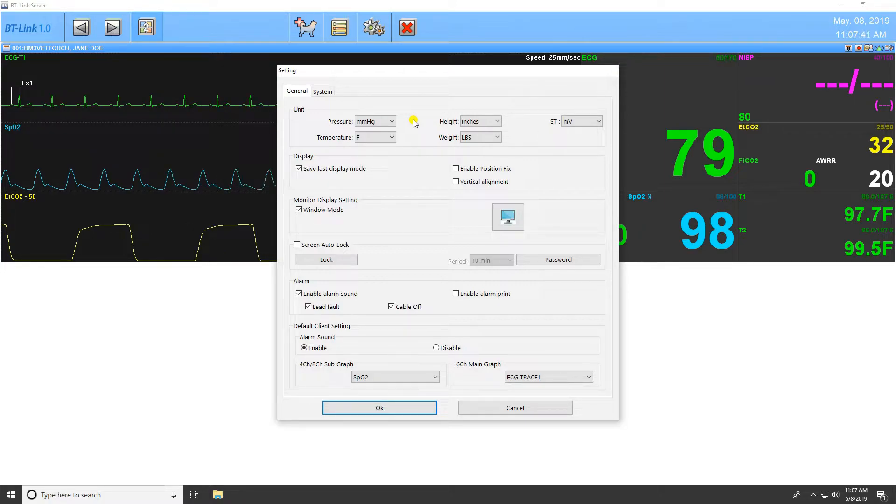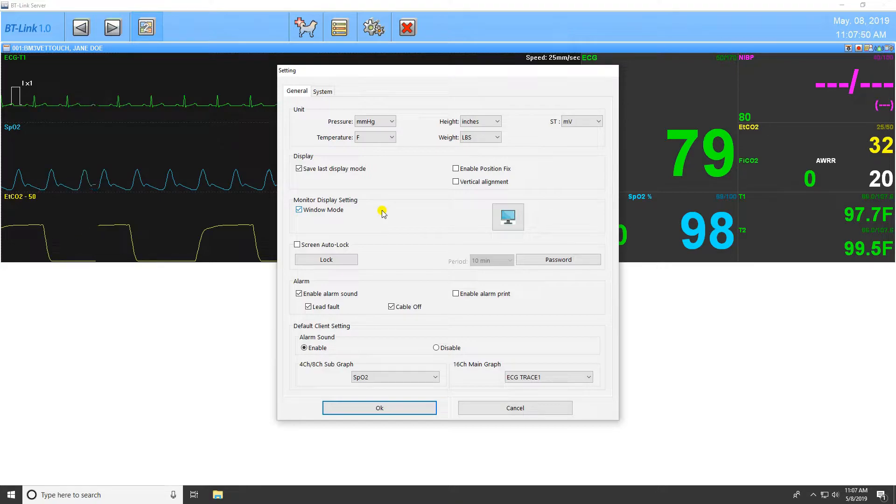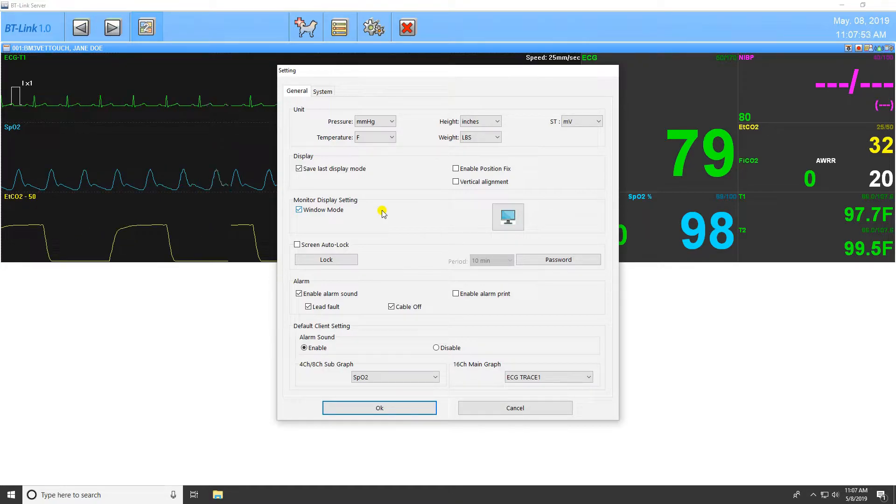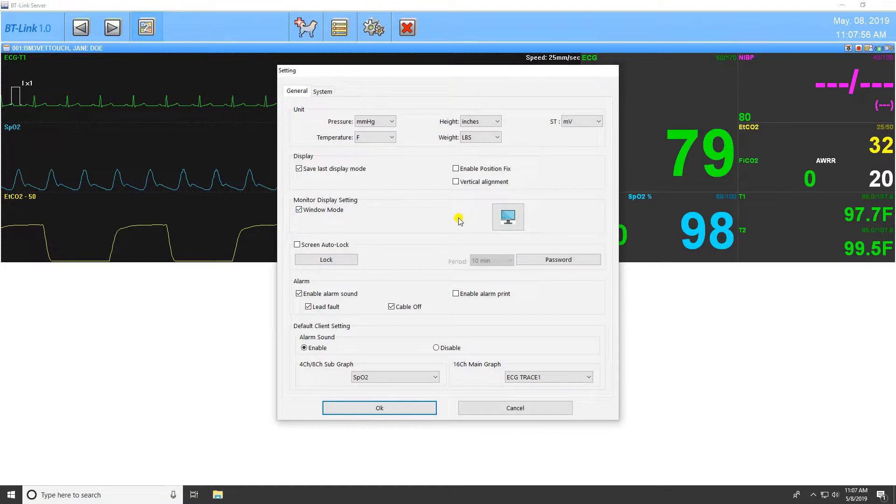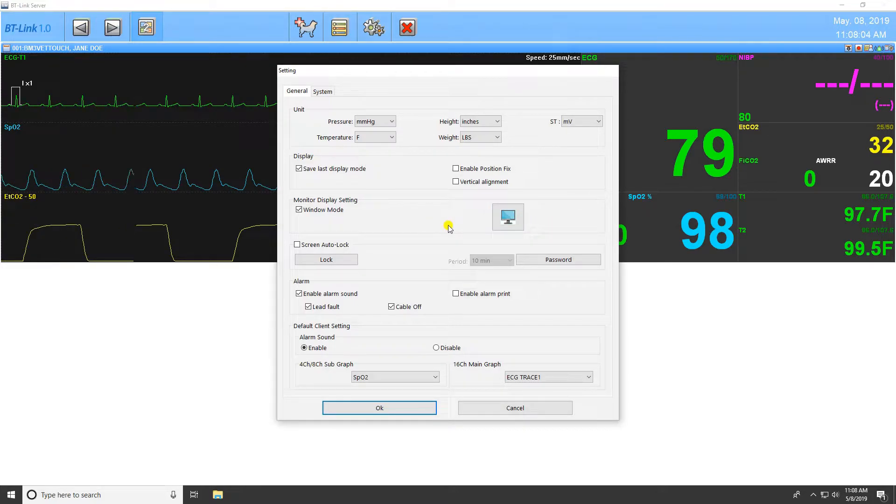The next set of parameters have to do with the display of the program. Under these options is the Monitor Display Settings, which allows for the option of a windowed mode of the program and demonstrates number of display monitors. BT-Link allows for two monitors to display the patient data from a Bionet patient monitor. The number of monitors displaying the data will be shown as one or two images of a computer monitor.